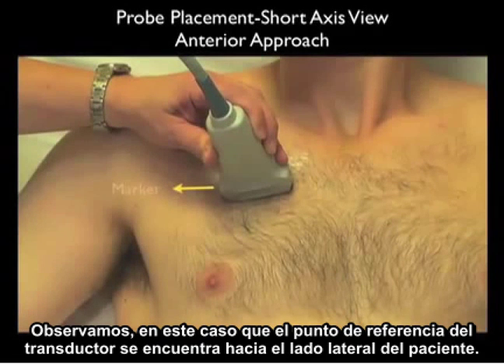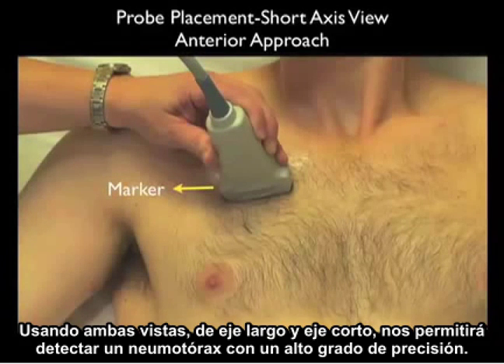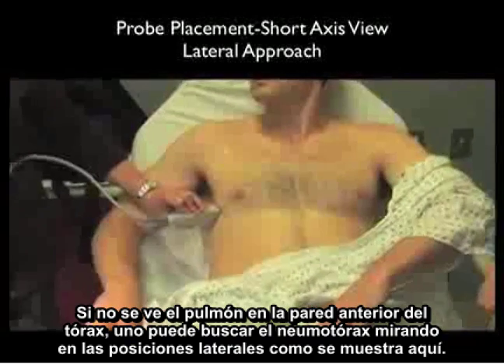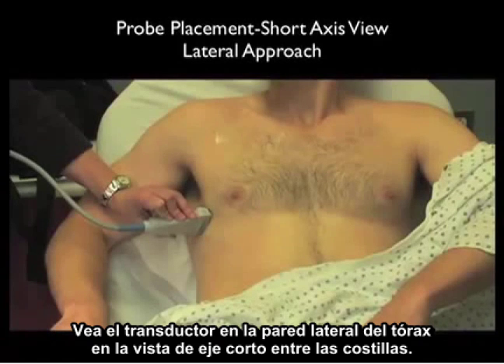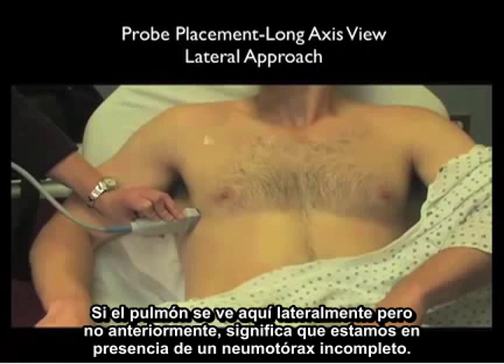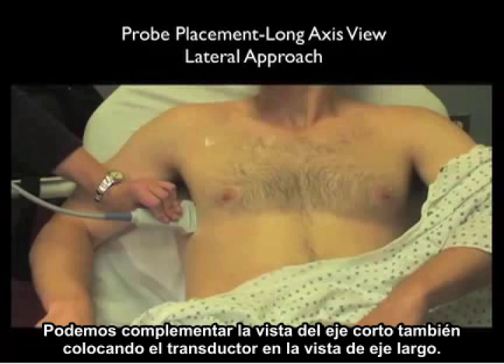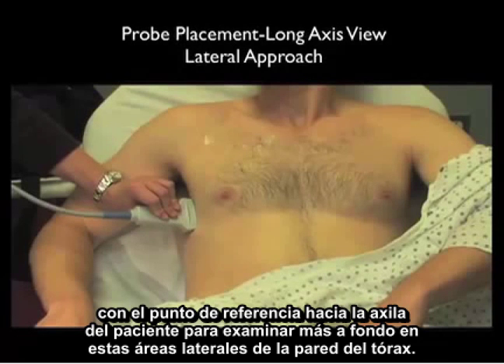Notice that the marker dot is located towards the lateral aspect of the patient. Using both long and short axis configurations will allow you to detect a pneumothorax with a high degree of accuracy. If no lung is seen on the anterior chest wall, one can size out a pneumothorax by looking in the lateral positions. Notice the probe on the lateral chest wall in the short axis configuration between the ribs. If lung is seen laterally but not anteriorly, this would tell you it was an incomplete pneumothorax. We can complement the short axis view by locating the probe in the long axis configuration with the marker dot towards the patient's axilla to further examine these lateral areas of the chest wall.